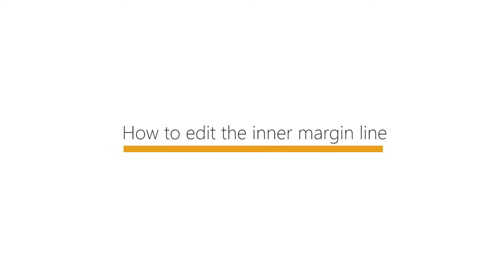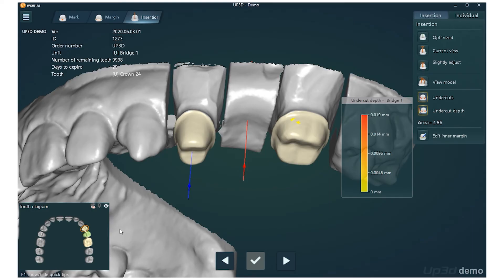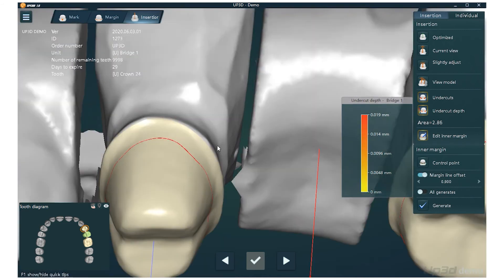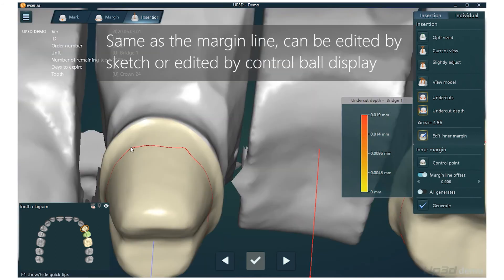How to edit the inner margin line? Click the Edit Inner Margin Line button. Similar to the margin line, it can be edited by sketch or edited by control ball display.